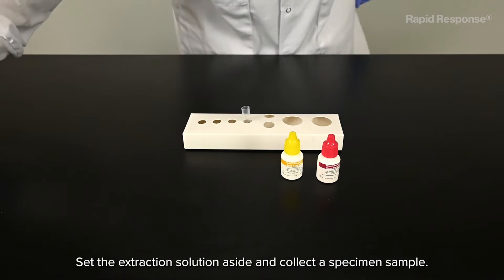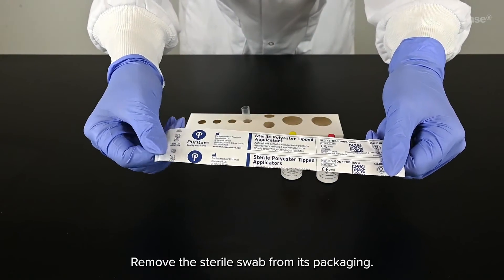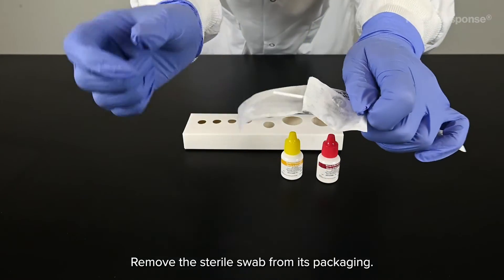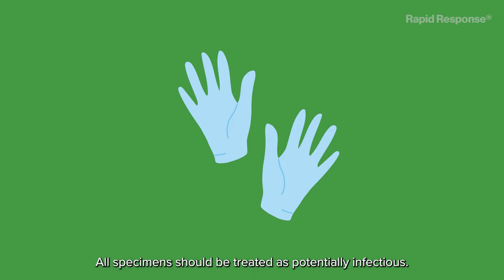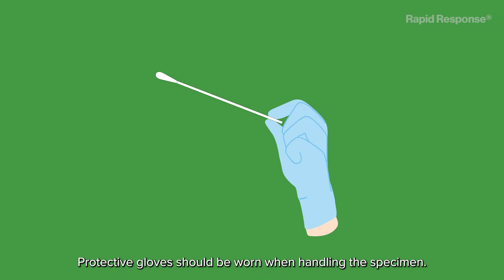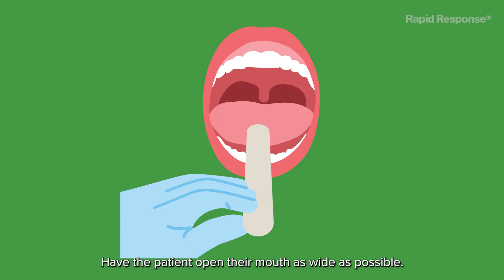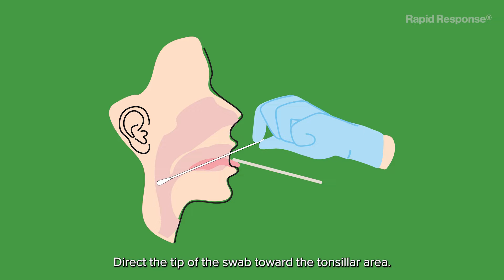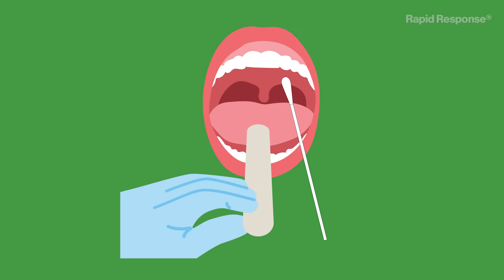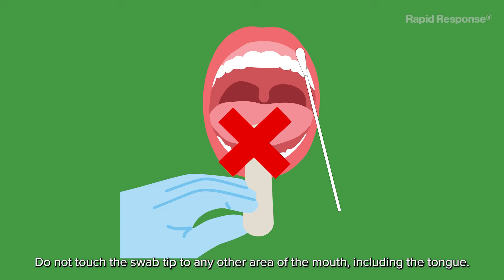Set the extraction solution aside and collect a specimen sample. Remove the sterile swab from its packaging. All specimens should be treated as potentially infectious. Protective gloves should be worn when handling the specimen. Have the patient open their mouth as wide as possible. Direct the tip of the swab toward the tonsillar area.